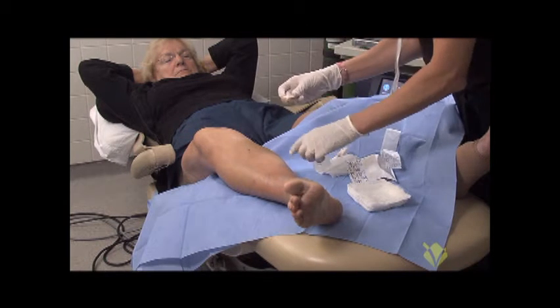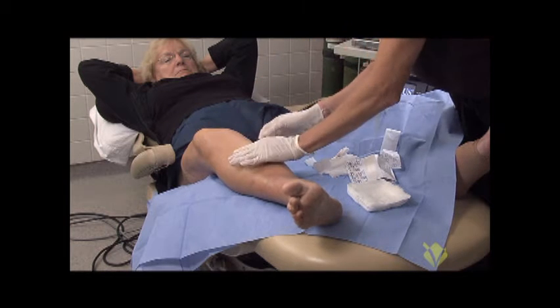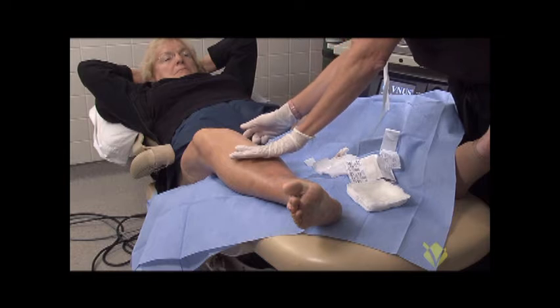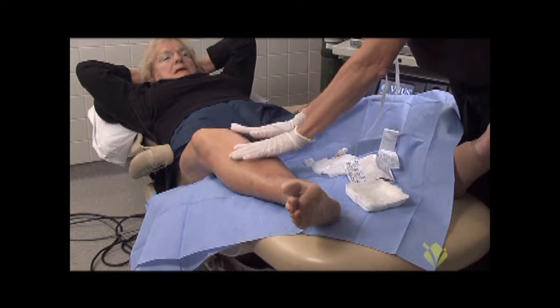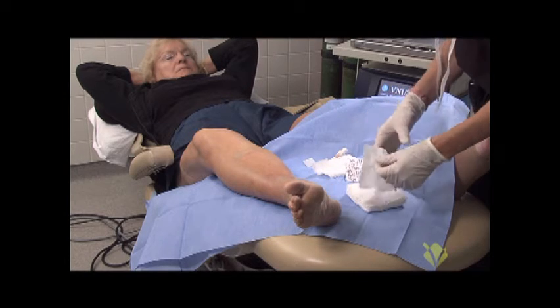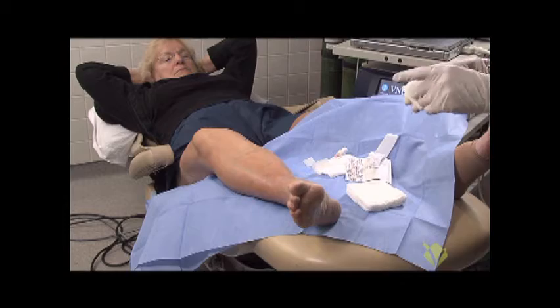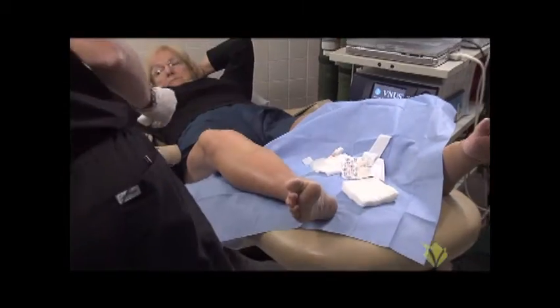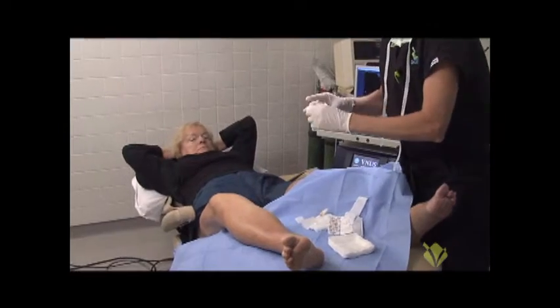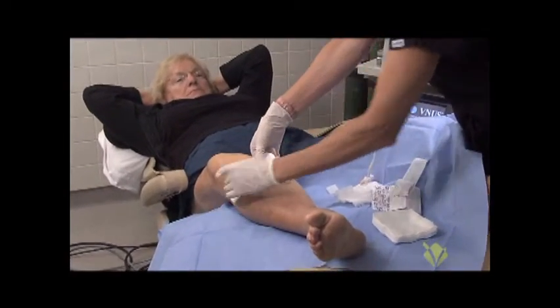It's normal for each of the sites along the leg where the tumescent was injected for them to leak a little bit. So there may be a little bit of oozing of fluid from these sites, and you'll see them on your stockings, and that's normal — it's a very small amount, not to be concerned. Then I take a gauze and roll it up into a little bit of a ball and make a compression-type dressing over the top of the band-aid.